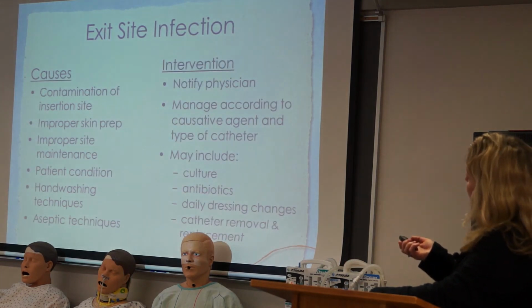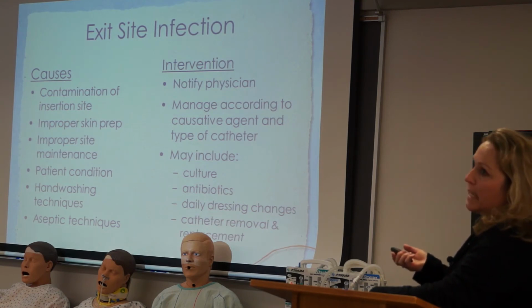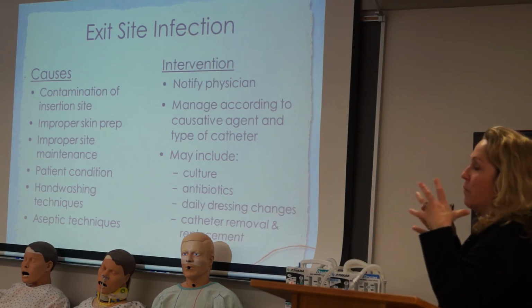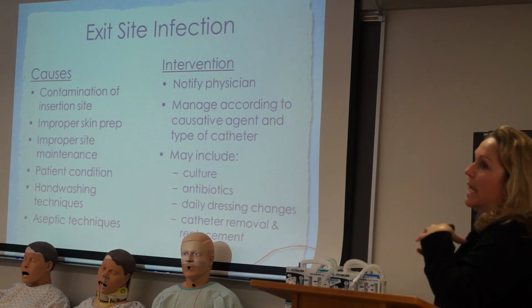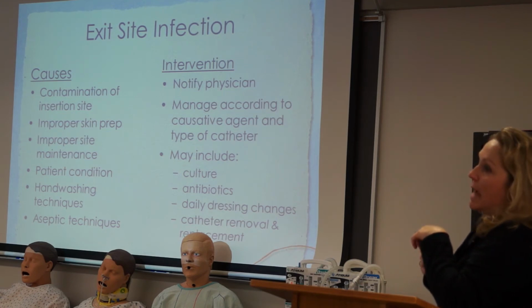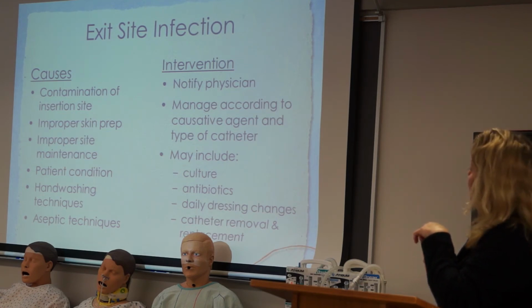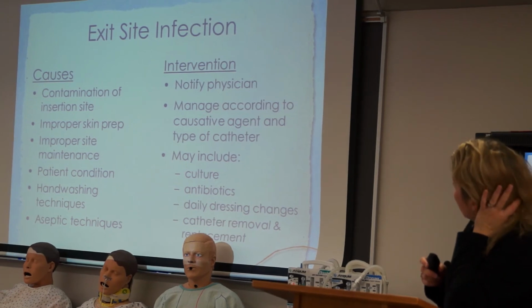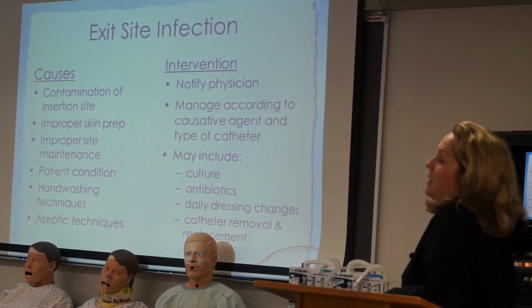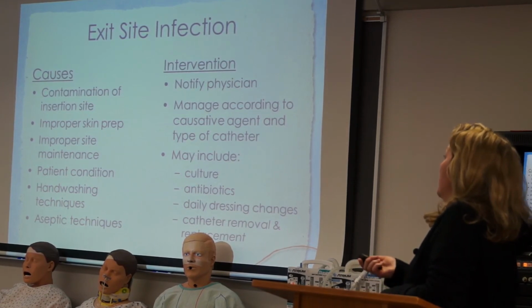Lots of causes for infection, but the main cause is just improper skin preparation and not using sterile technique. So we can't really push hard enough the importance of using good sterile technique when handling any central line or even a midline, and using aseptic technique when you're accessing these vessels. So if you think that the patient has an infection, you want to make sure you notify the physician right away. They probably are going to have to take that out and put them on some kind of antibiotics.